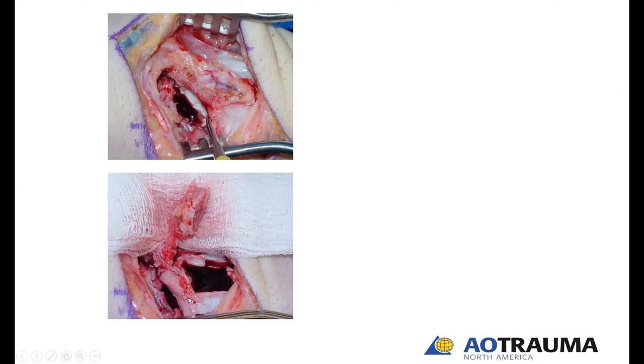The pedicle continues underneath the retinaculum, so you have to incise the floor of the first compartment once your pedicle is identified and graft cuts made to trace this down. I do this subperiosteally to elevate as much soft tissue off those vessels as I can. Here we can see that graft harvested — I've used sagittal saws on the sides, taking care not to go across the pedicle. You have to sneak under it with a scalpel right up against the bone, elevate the pedicle, and then make the distal cut.